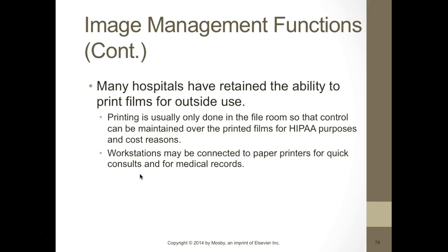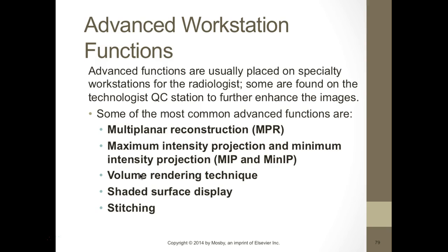So when you're up in OR, you can actually print the ankle right there and give it to the doctor for the chart, or bring it downstairs for the radiologist to mark up to give to the doctor. So advanced workstation functions.